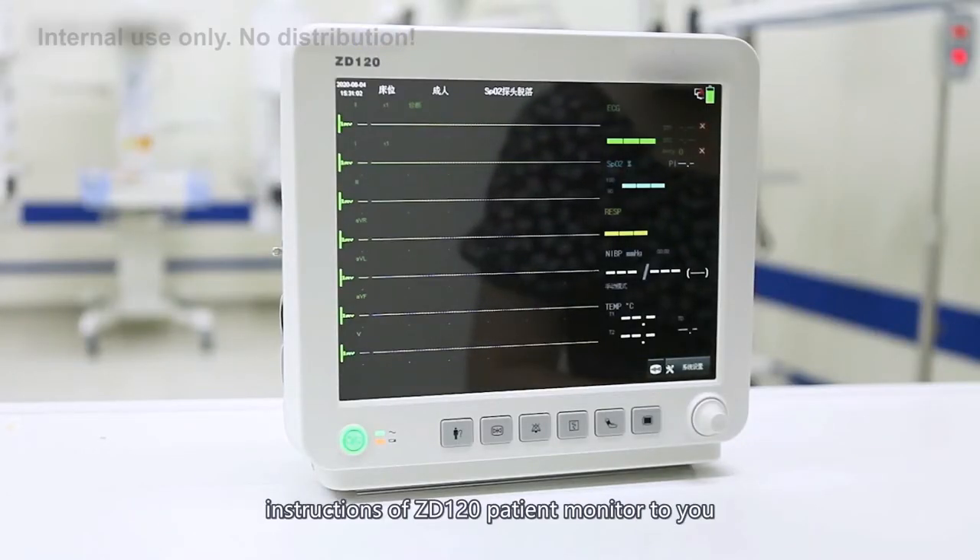Hello, let me introduce the operation instructions of the ZD120 patient monitor to you.